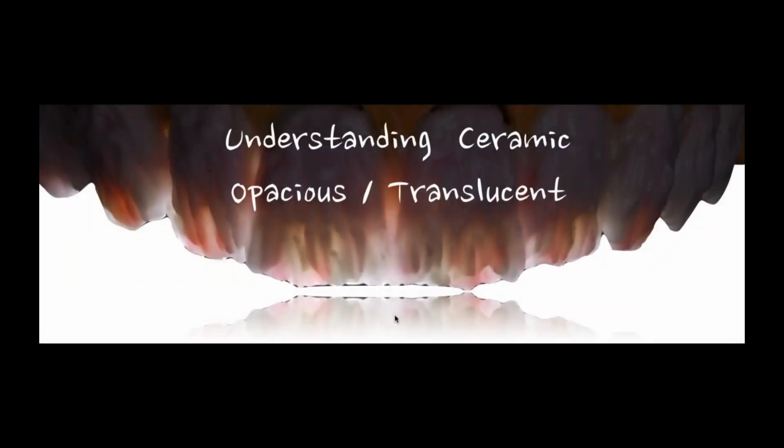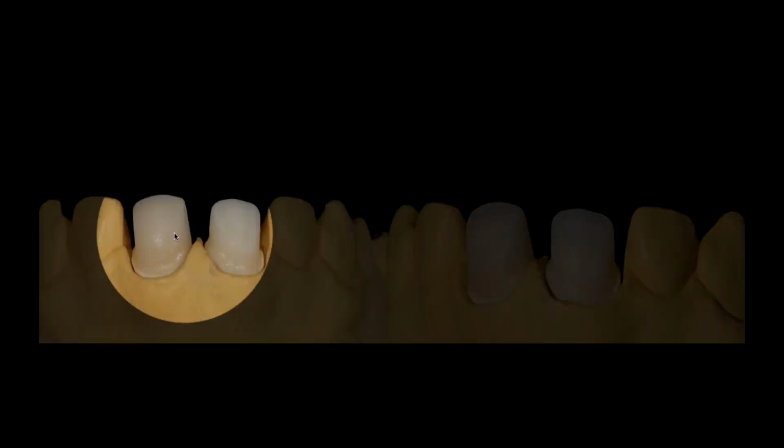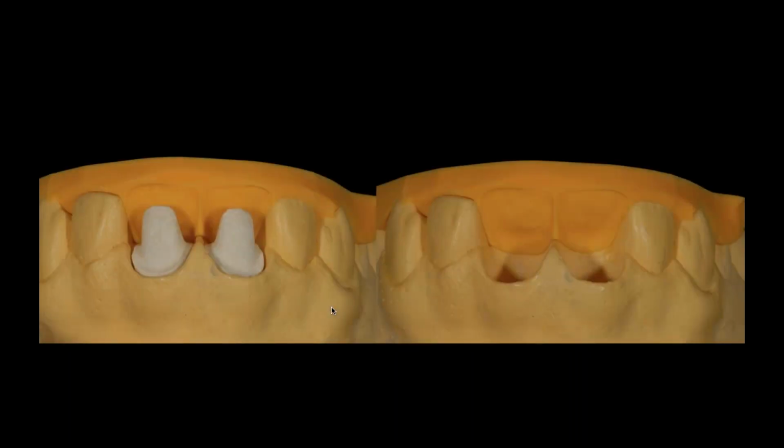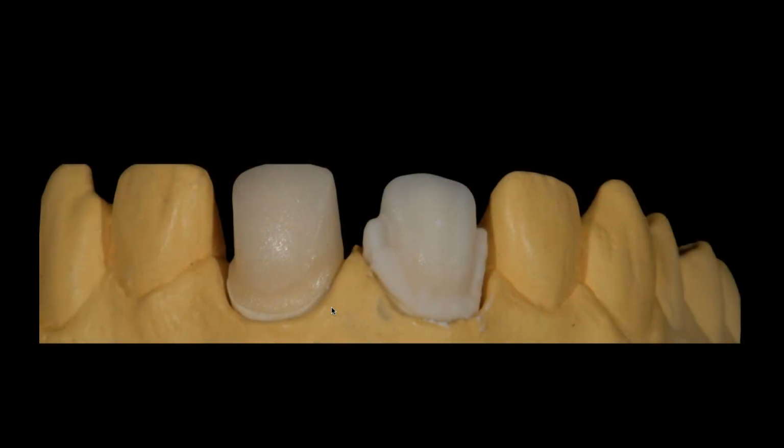And this is kind of the best example I could think of for you to really understand the internal opacities of the restorations. So let's take these 2 units. I have 2 zirconia units. You can see that I've done pretty much nothing to them. They're just kind of cleaned up, no real coloration on them, just the normal 2 units, right? What I'm going to do with those 2 units is show you the amount of spacing that I have to work with. I have a nice amount of space, 1.2 to 1.5. So this is ideal. And if I'm going to build based on the manufacturer concept, let's see what happens.